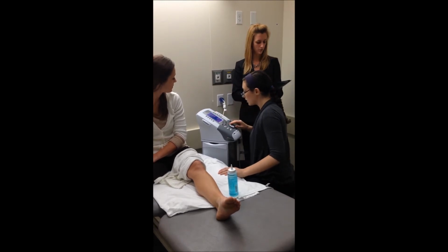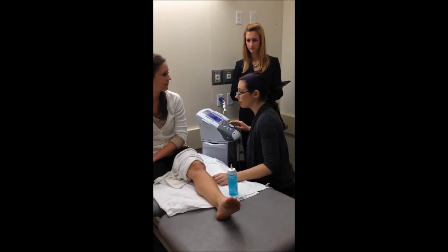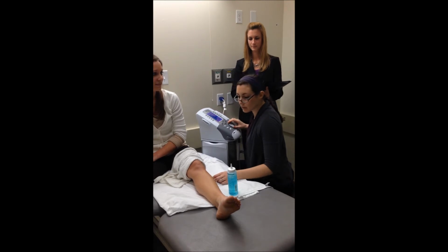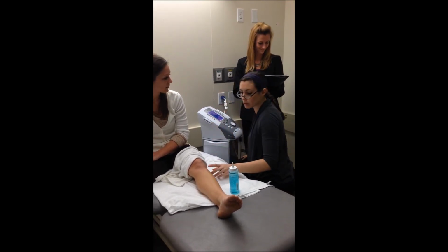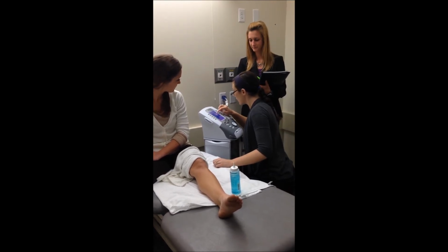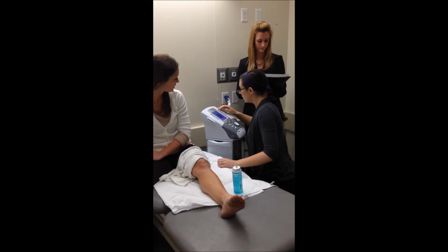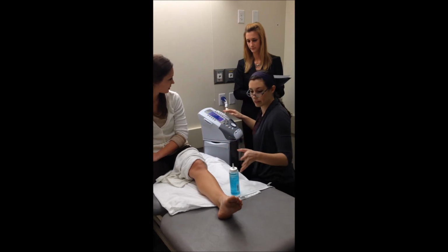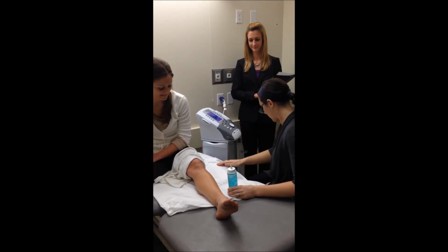What are you going to choose? How tough are you? Okay, we'll do low. We'll do it real low. How about like 1 W/cm2? Okay. And then it's already on 100. I think that's probably right. Okay. And I know we got to do 8 minutes, so I'm going to do 8. That's what I've been taught, so that's what I'm going to do.